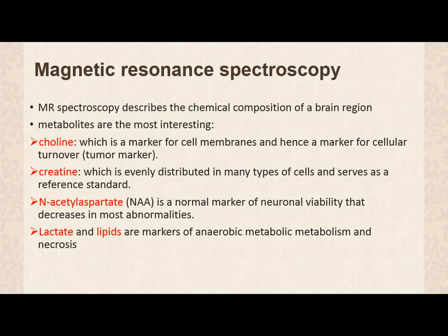Spectroscopy is a little bit complicated subject. However, we measure the concentration of metabolites in a specific part of the brain, like a tumor or abscess or whatever.